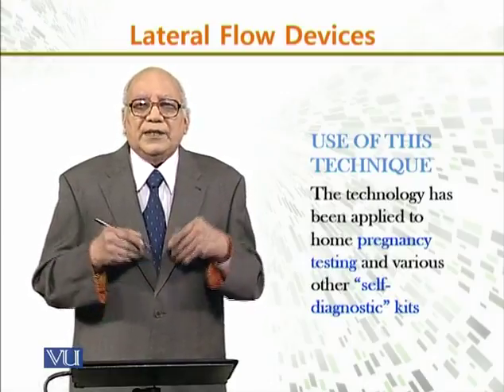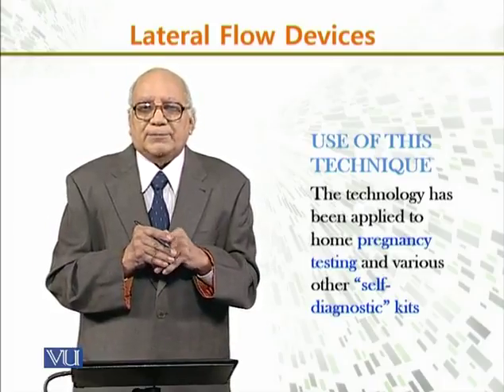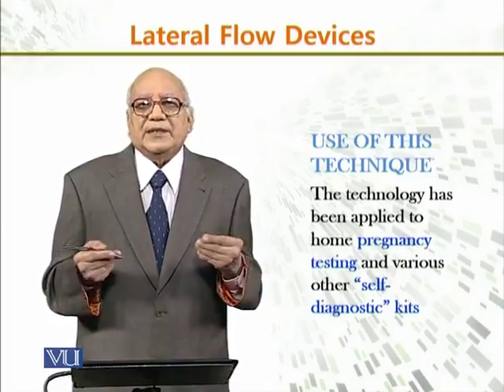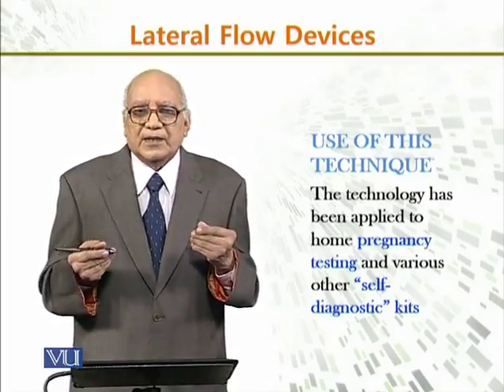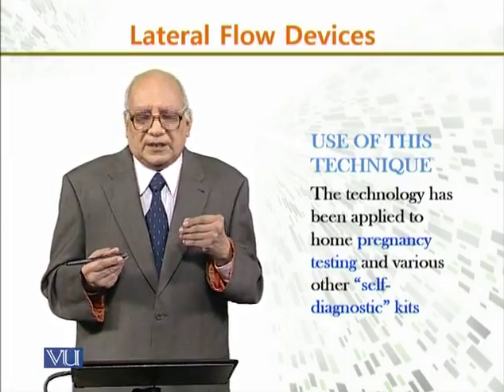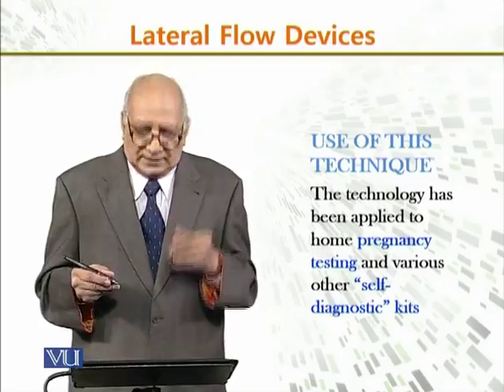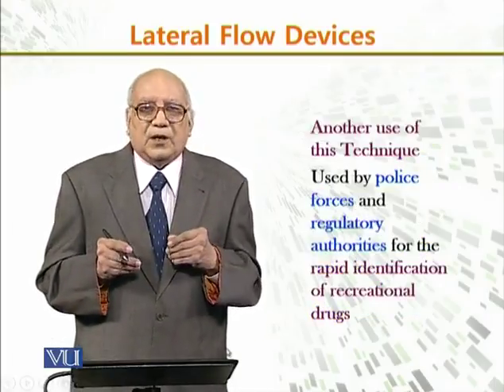Now, where can this technique be used? This technology has been applied to many important tests, like home pregnancy testing and various other self-diagnostic kits which can be used everywhere.